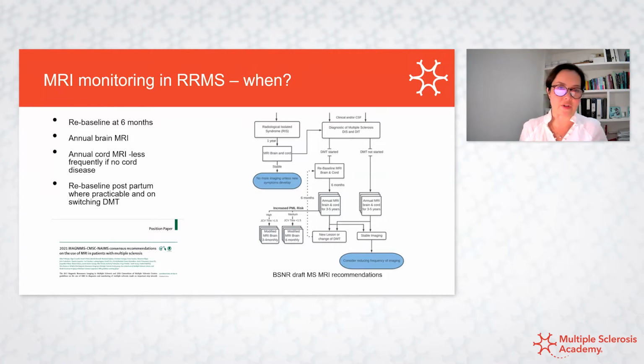Because we can't make a decision because of technical differences between scans, and we can't tell if there really is a new lesion or not. So the guidelines being developed by the British Society of Neuroradiologists in conjunction with the Association of British Neurologists are quite simple and specify timing and how to do scanning, including what planes and what sequences to do.